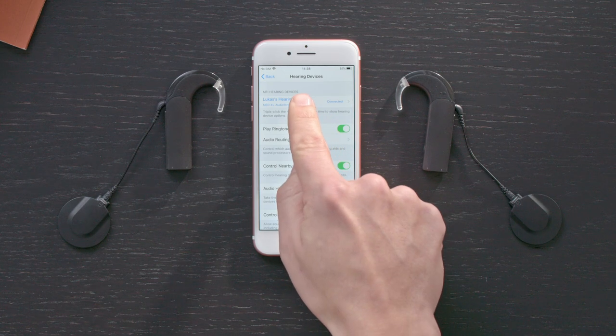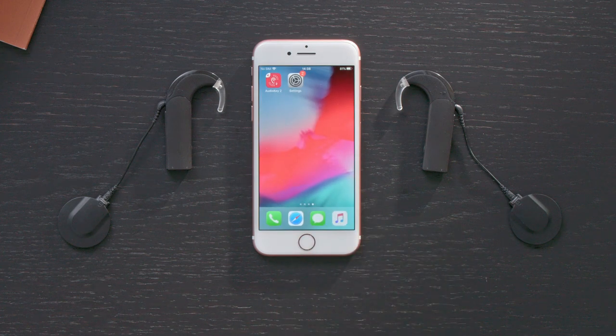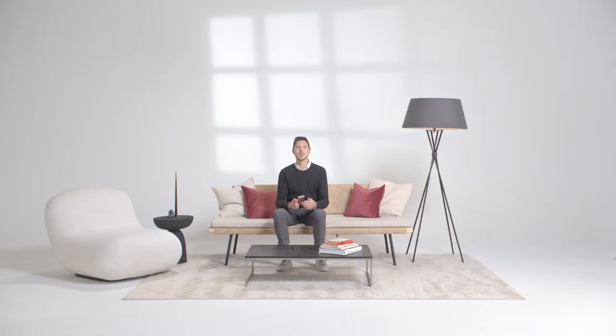After a few seconds, it will indicate that it is connected. AudioStream will connect automatically whenever it is switched on and your phone has Bluetooth enabled. Now you are ready to start streaming music and phone calls directly to your AudioProcessor.